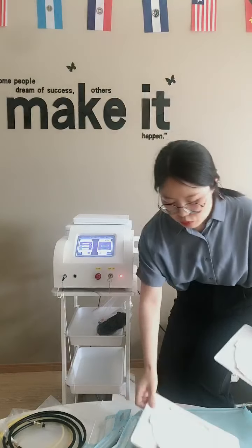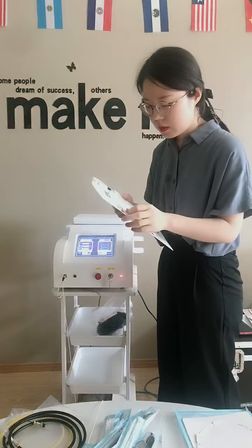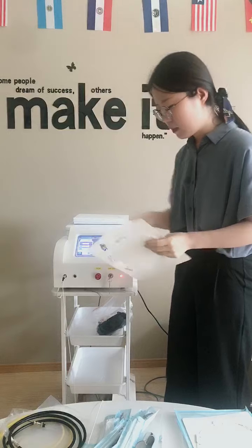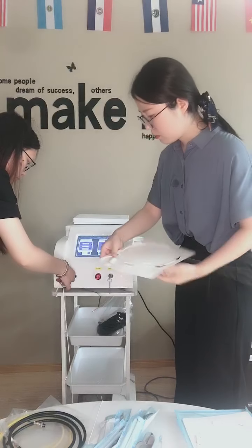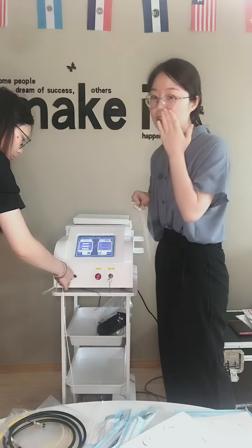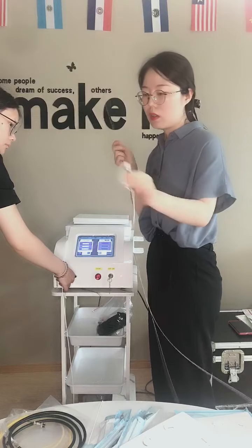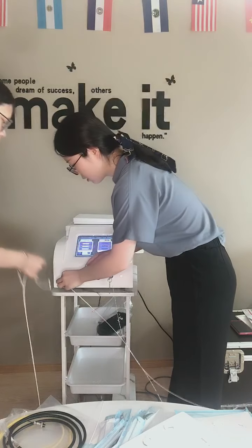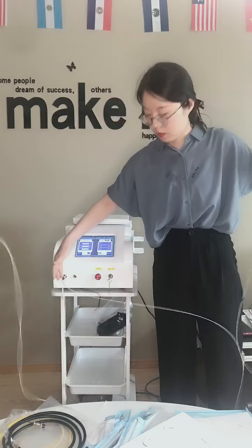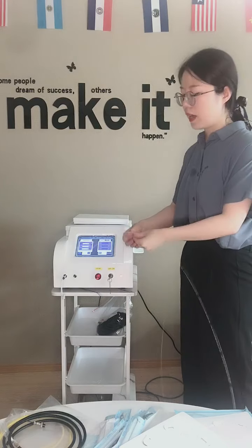And right now I'm introducing you to the hemorrhoids. So we are using the soft elastic here, this one. The connector cannot be exposed to the air for a very long time, so when you apply the new connector of fiber, you need to be fast. You need to pay attention to this connector and protect it very well. Don't expose it to the air for a longer time, so the dust won't get in.